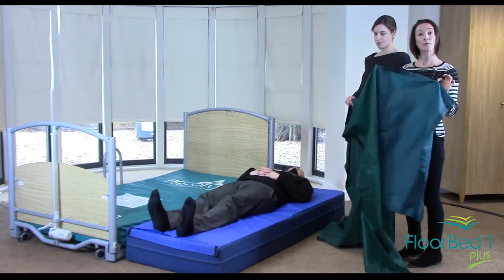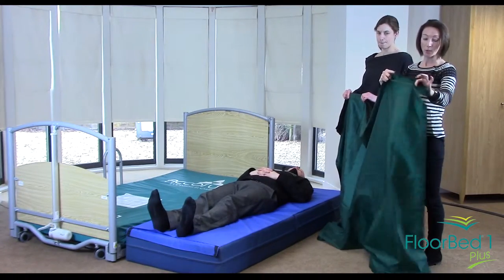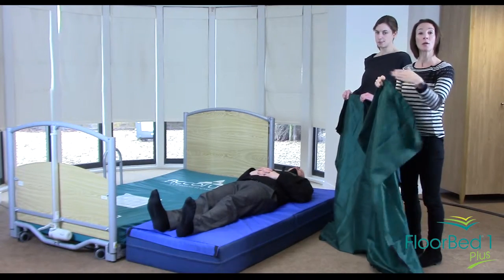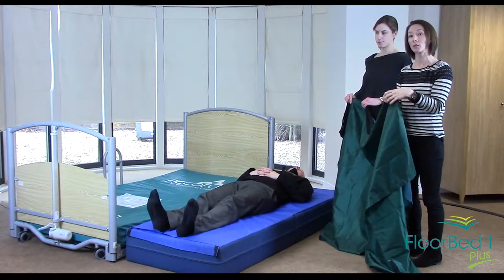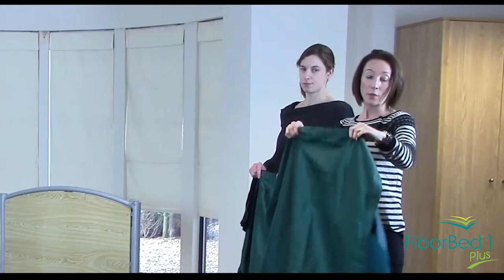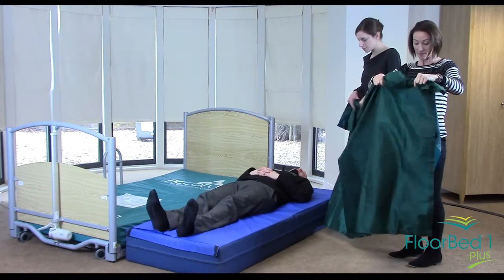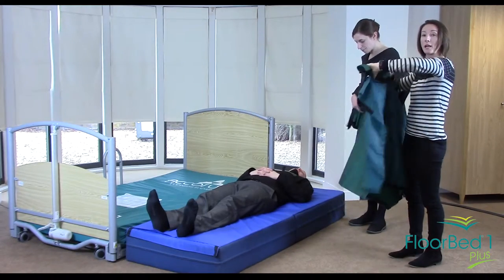I'd recommend you get two flat sliding sheets. The bottom one will be larger than the top one — this will need to cover part of the safety mat as well as part of the bed. What we'll do is shuffle up the bottom layer first, bring that up, and then the top layer a little bit as well.